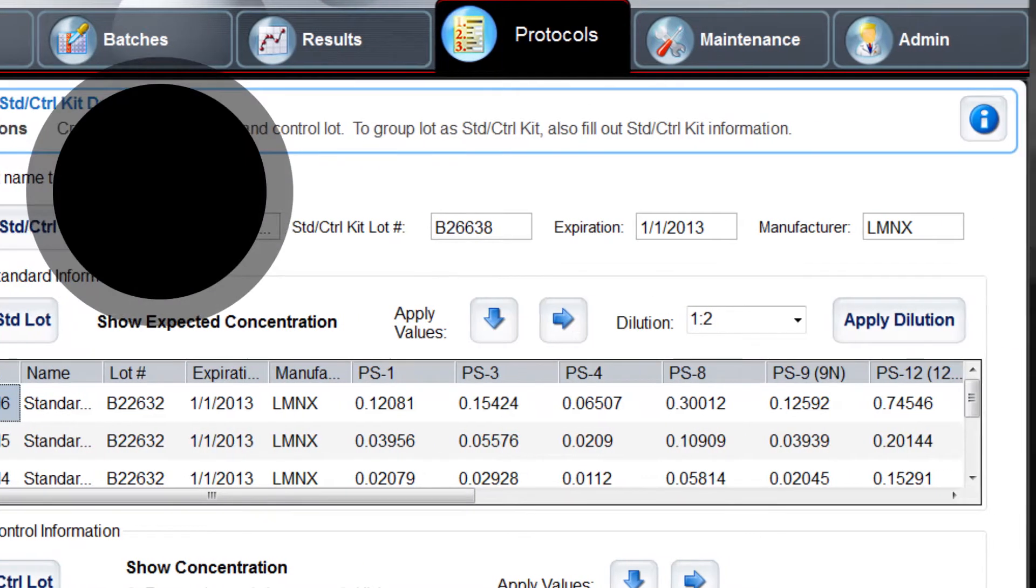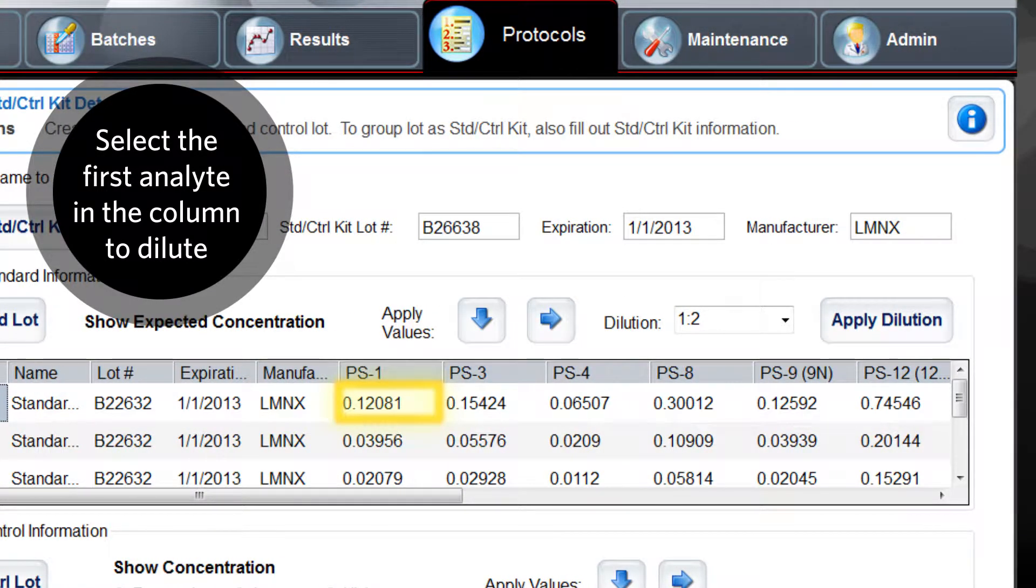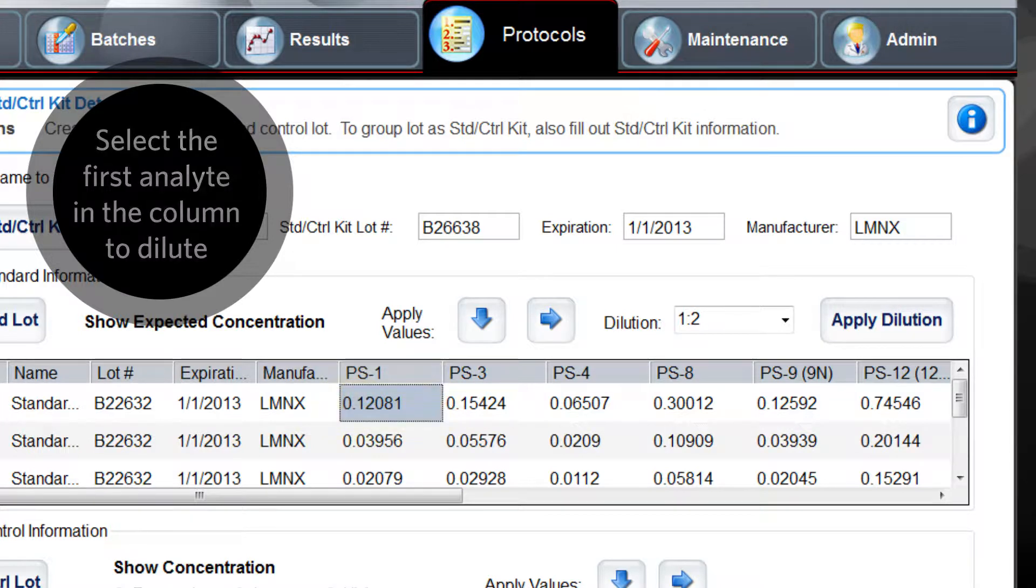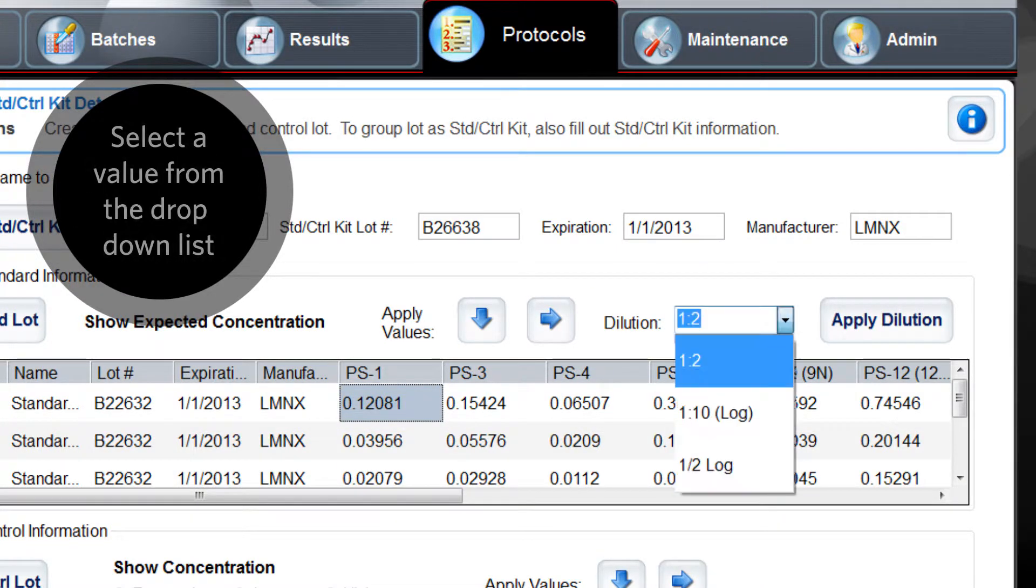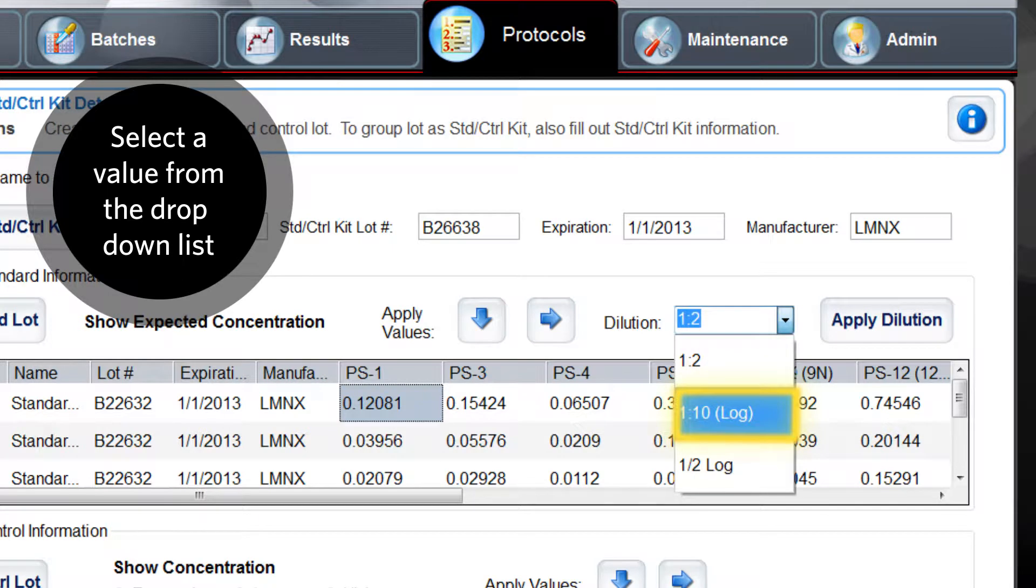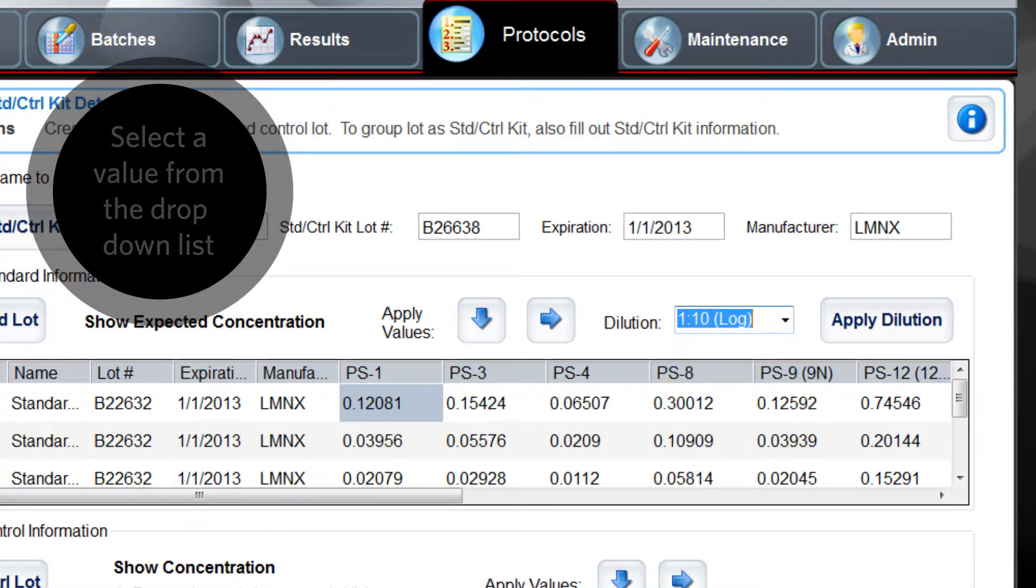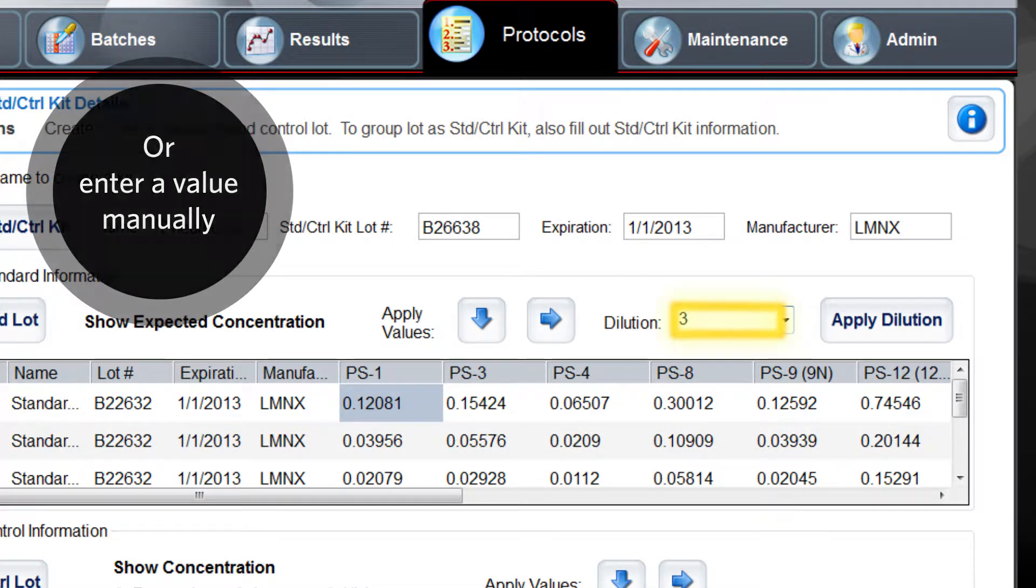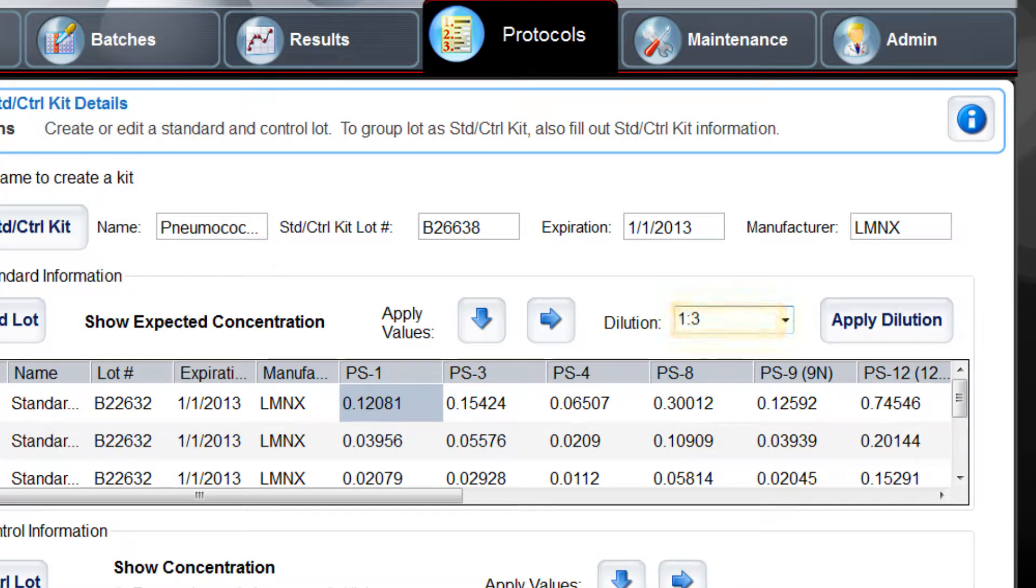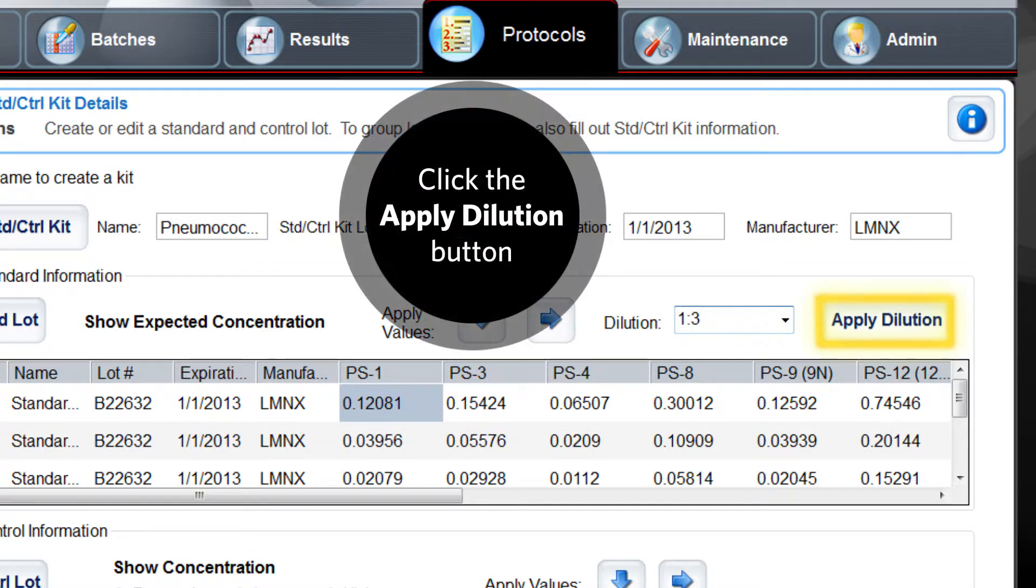Then, select the first analyte in the column to dilute. From the dilution box, select a value from the drop-down list or enter a value manually. Click the apply button next to the dilution factor.